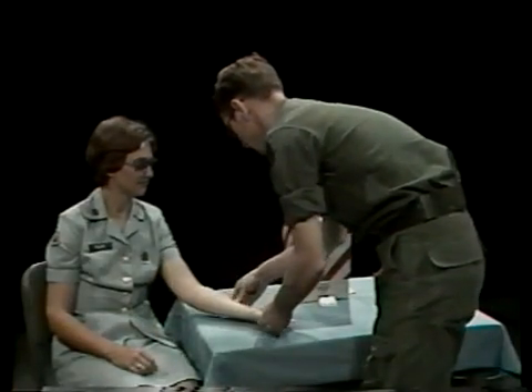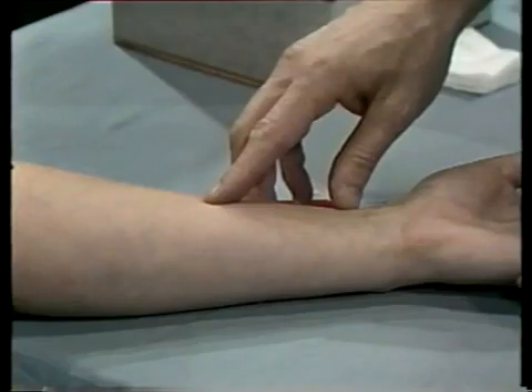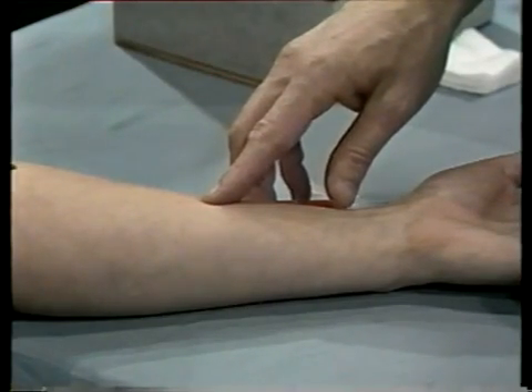For an intradermal injection, select a site on the inside of the patient's forearm — the side which would be exposed when the hand is palm up.